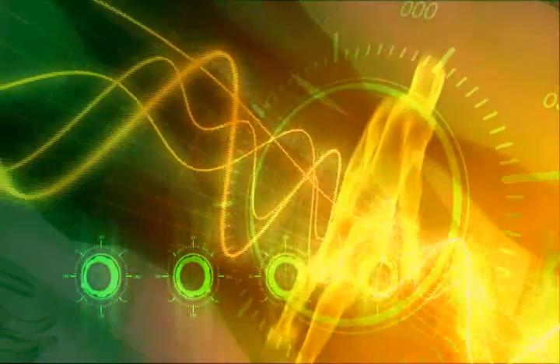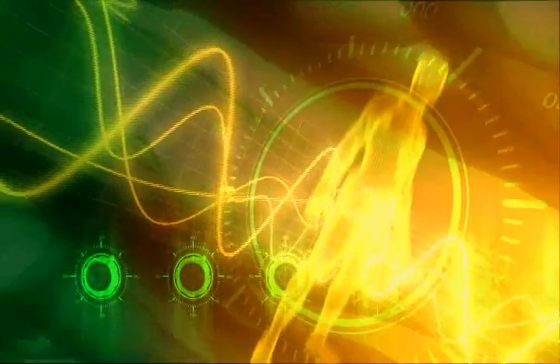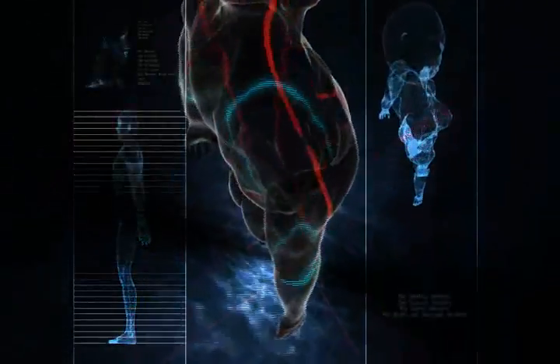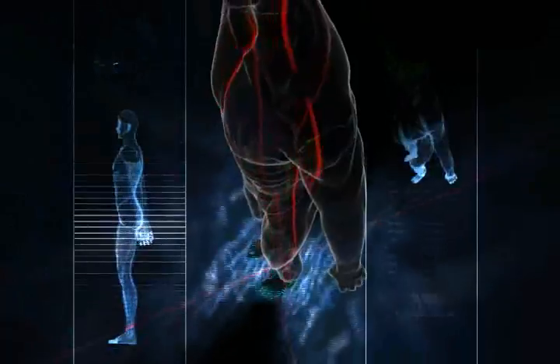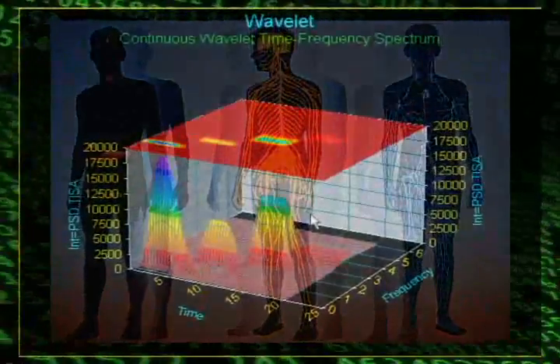CME processor works with electromagnetic thermodynamic signals with the frequency range from 0.001 Hz up to 386 GHz. A new detection method using specialized hardware based on the principle of wavelet transformation for medical purposes.